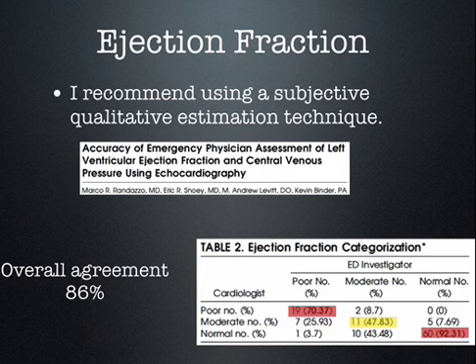Now, ejection fraction. Is ejection fraction normal? Well, first off, as emergency physicians, can we determine ejection fraction? This is one of those studies that's a little bit frustrating, where we use the cardiologist as the gold standard. And basically what they were doing was comparing eyeball assessment, which I'm going to teach you how to do, and you're going to see you can do it yourself here in just a second.